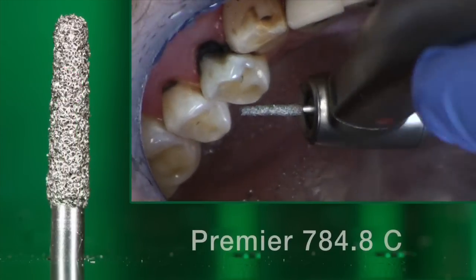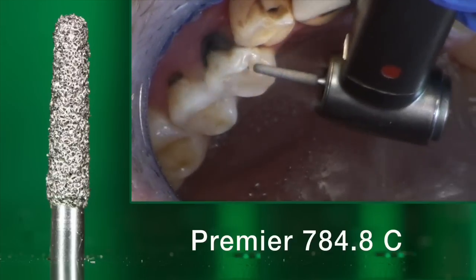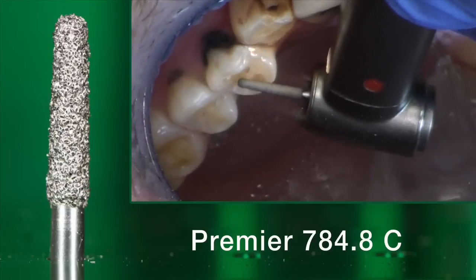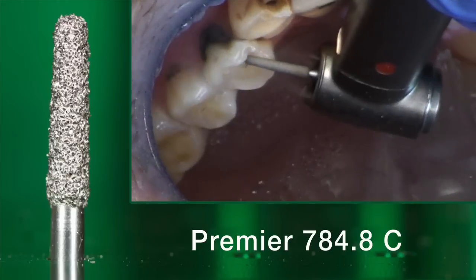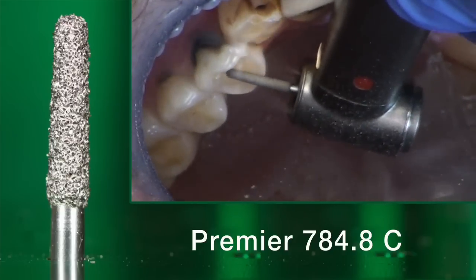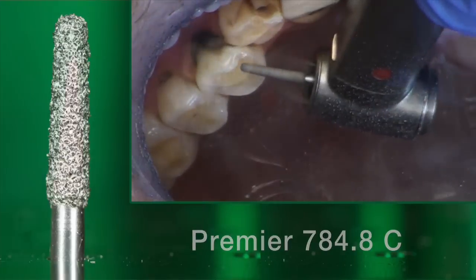Next, I'm going to take my round end tapered burr and connect those dots in order to achieve the correct occlusal reduction. Very simple, very fast. And then I know that I have adequate reduction for this particular material for an all ceramic crown preparation.